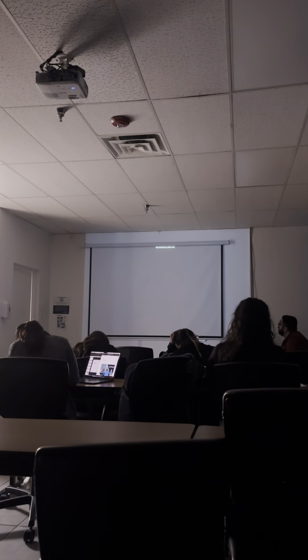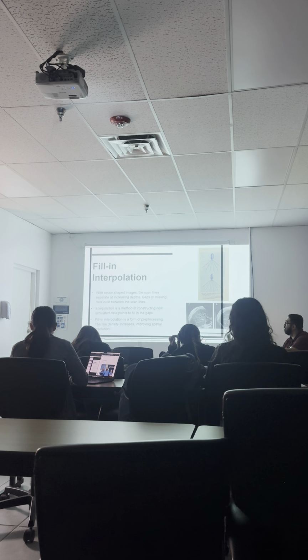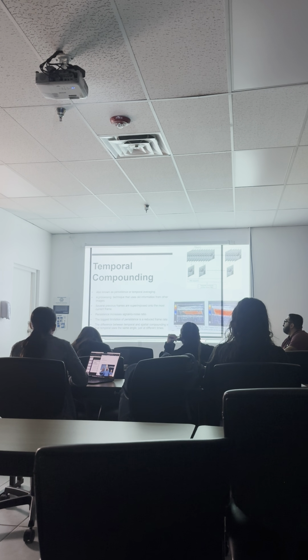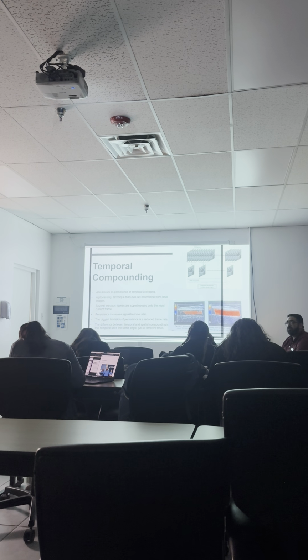Does this affect bioeffects? No, it's just using pictures from an older time. The biggest limitation of persistence is a reduced frame rate. And if we have a reduced frame rate, what else do we have? Degraded temporal resolution.